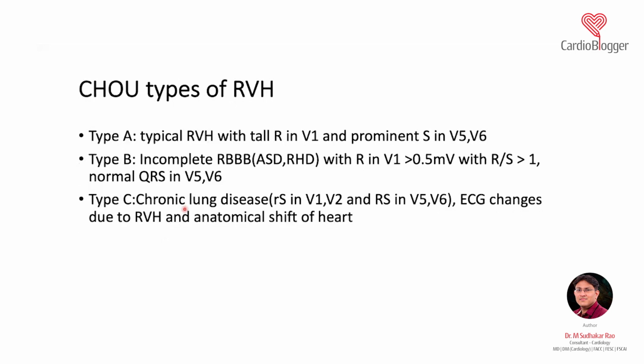Now this is something very important. In most exams, they may ask you, what are the various forms of RVH?